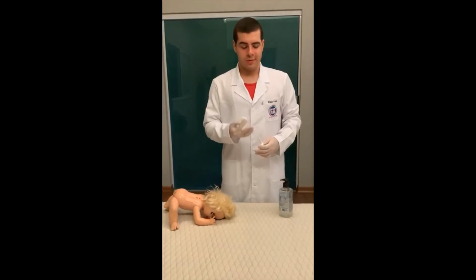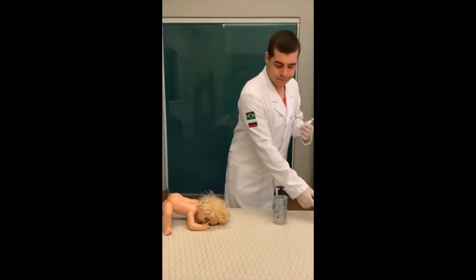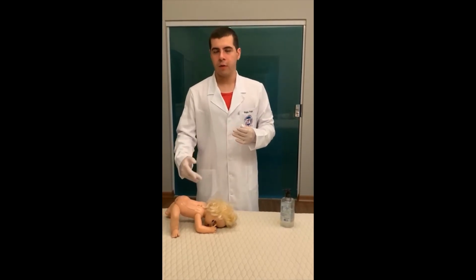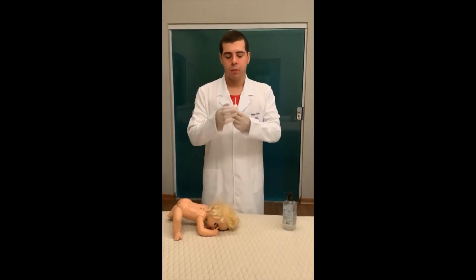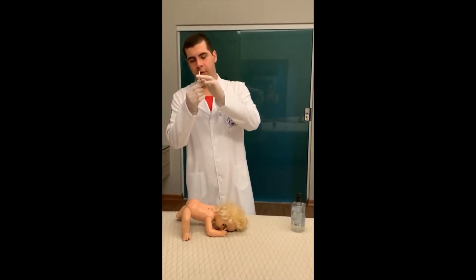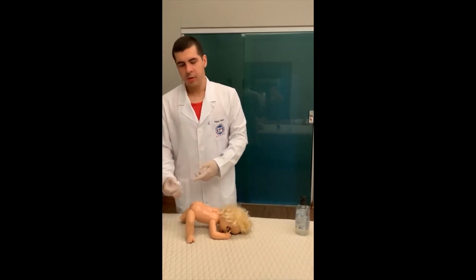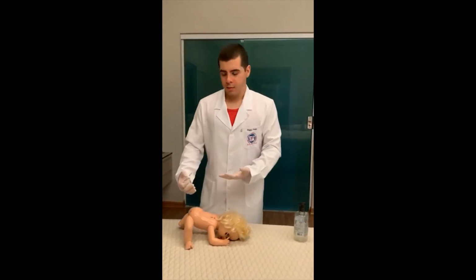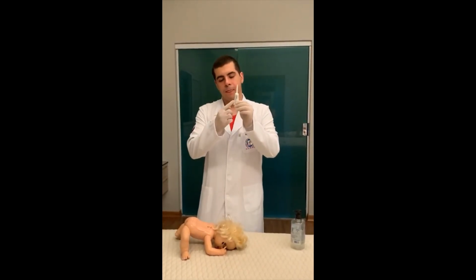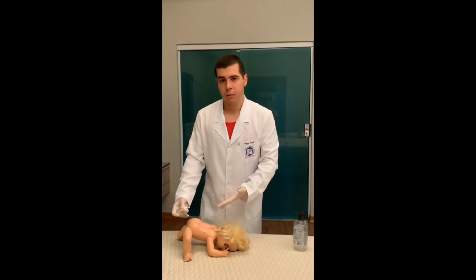To initiate the procedure, first of all, we need to lubricate the drug. Then, in case of children, after you remove the blanket, the cover, and prepare the local, we will need to introduce. First, we need to remove the cover of the drug. Introduce in children 1 inch in the rectum. Then we will need to put all the med inside the cavity, the bowl.